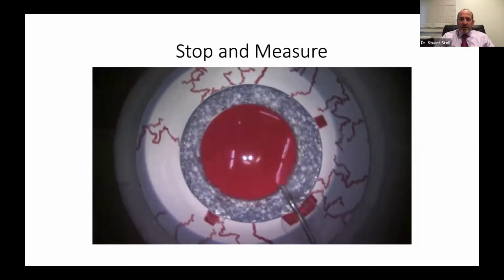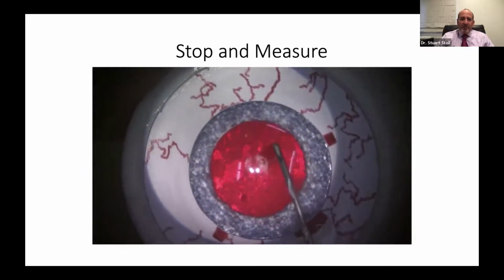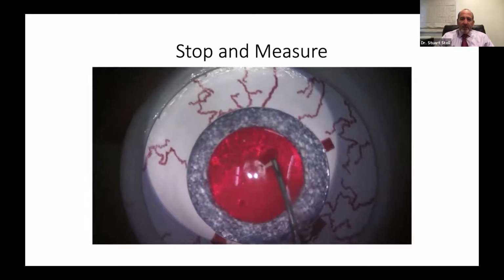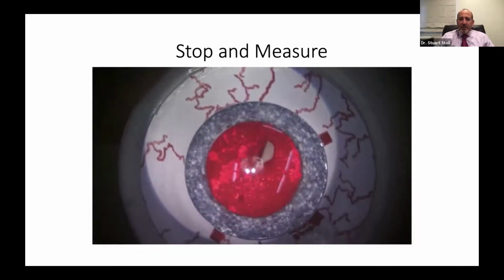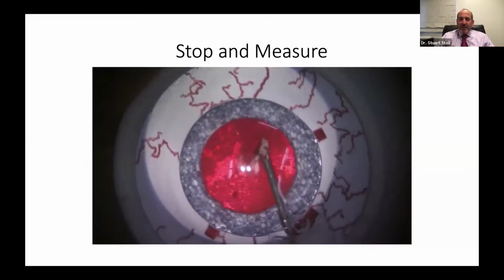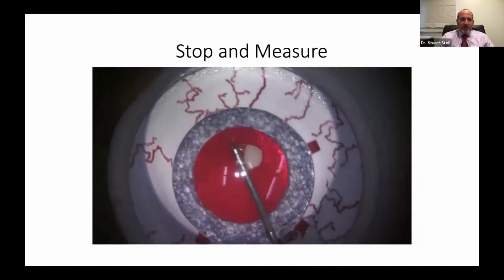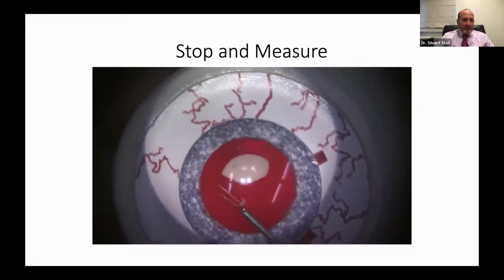So here we're going to initiate. Now we're going to go a different way. We're going to bring it up and around, just trying a different technique. Maybe we like that better. This is not how I choose to do it, but some people like this. You can see it does leave the capsule in a nice position to come in there and grab it very easily, get the forceps on either side of the capsule, and you start your capsulotomy.